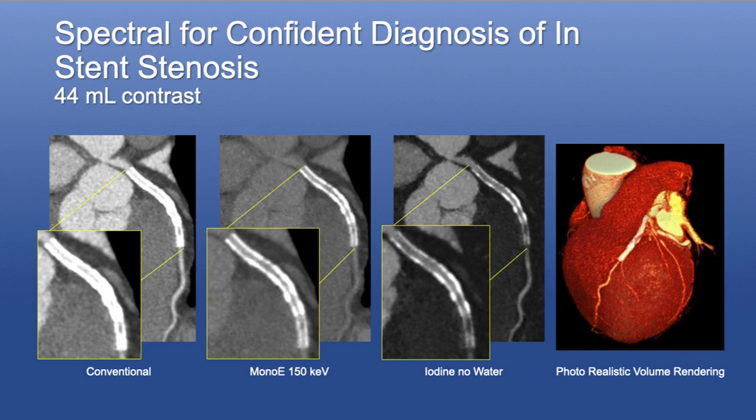So I don't know how many stents you're imaging in your institution. We don't do as much here, but we do some. We do some because the patients have large stents and we want to determine if they're patent or not. And sometimes we get referrals from patients that the referral doctor didn't know the patient had a stent, or they're trying to evaluate the other coronary arteries, but we also want to be able to comment on the stent.